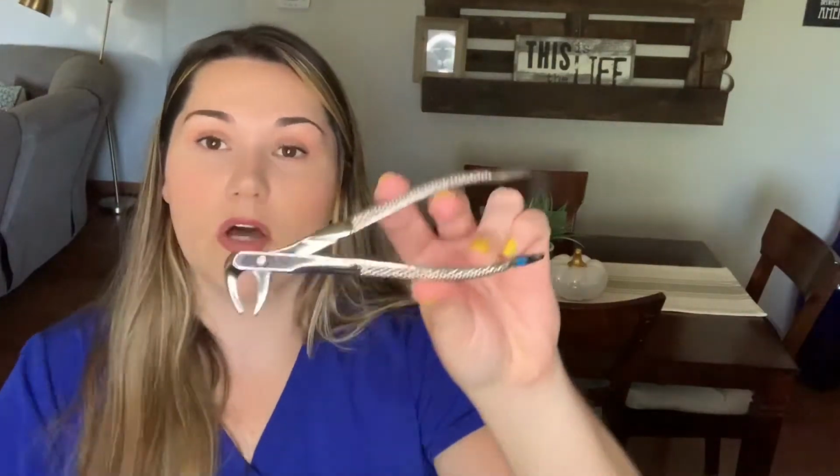This is a lower anterior. So this is designed to grab these teeth right here, like so. Wiggle those puppies out. I don't have many other ones. So yes, he'll be using the forceps next.